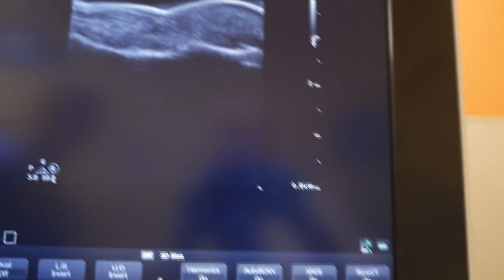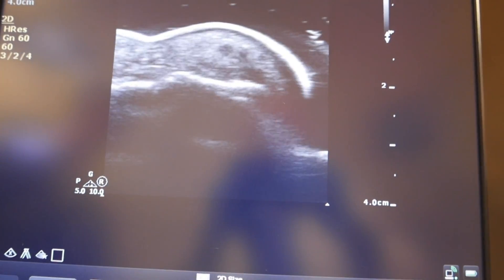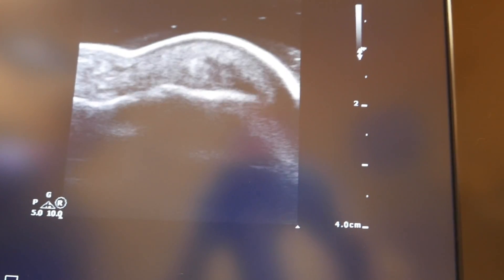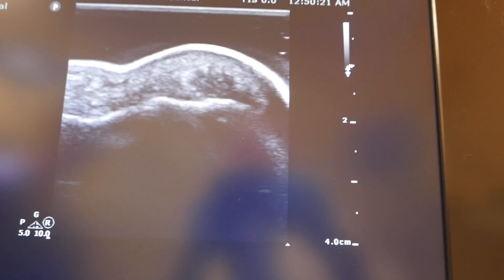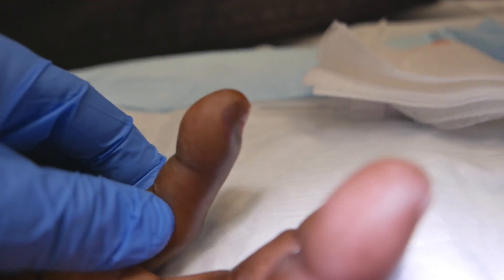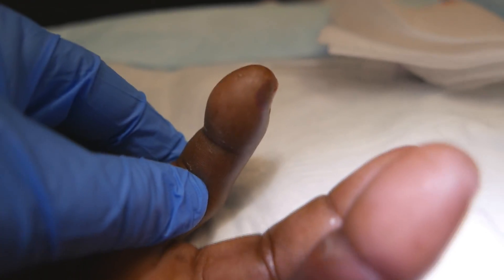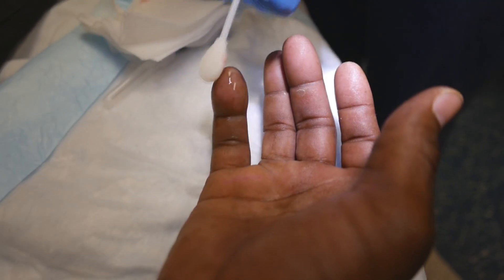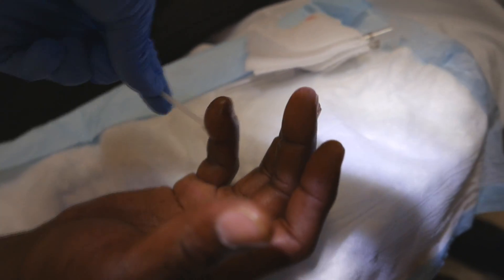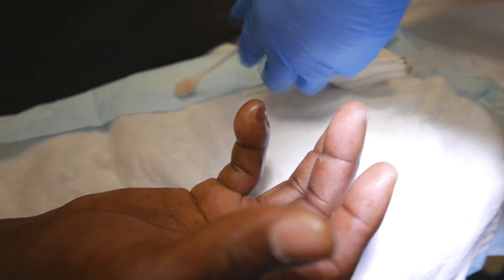There we go — it's just a little abscess pocket in this felon, sitting right over top of the bone. We're going to use an 18 gauge needle to drain that out. So we basically have a felon here and we'll do a needle aspiration, sterilize a little bit. We're going to come in lateral because that's where we saw what looked like a little fluid collection.